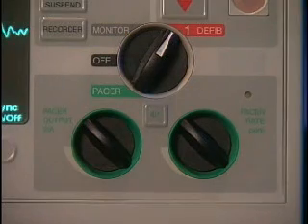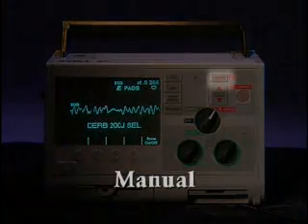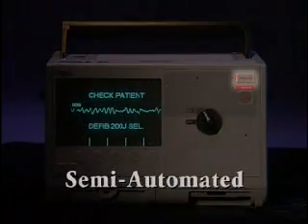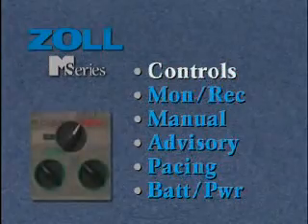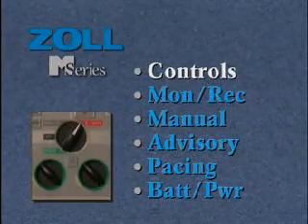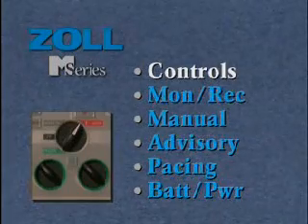All models of the M-Series have the Zoll Uniform Operating System. Manual-only models have a charge button. Advisory and semi-automated models have a charge and/or analyze button. The first section of the video, Standard Operating Controls, describes the basic operation of the Zoll M-Series. All operators should view this section.